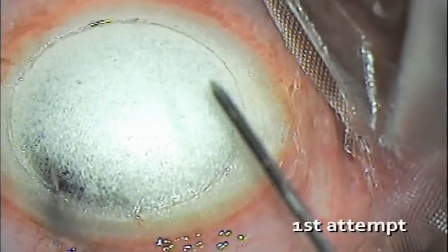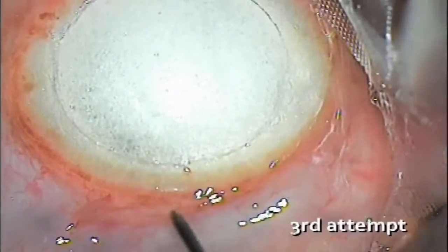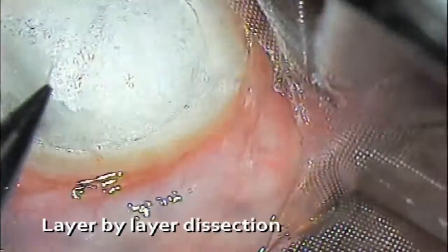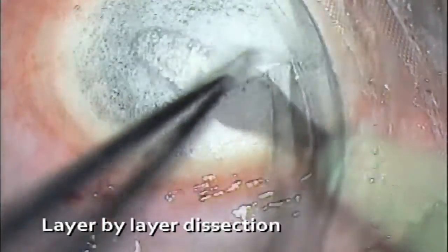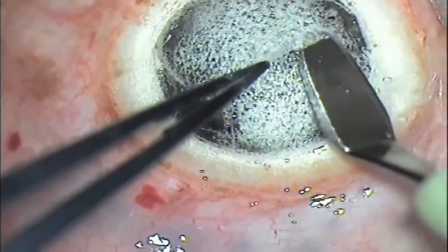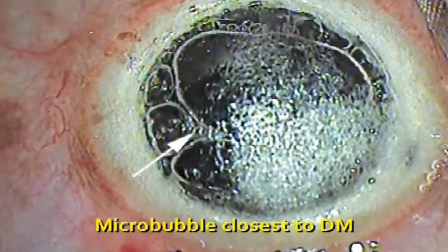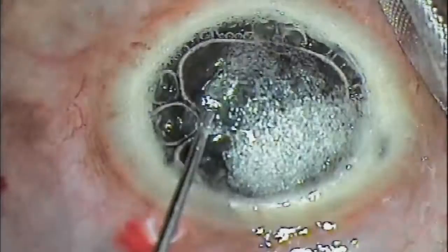In another case, the first and second attempts at achieving the big bubble failed. The third attempt also failed to secure the entire cornea. A deeper incision was then given, and layer-by-layer dissection of the stroma was carried out until the desired depth was reached. These steps were repeated until the perfect microbubble was identified. The microbubble closest to the Descemet was identified and Descemet baring was performed.